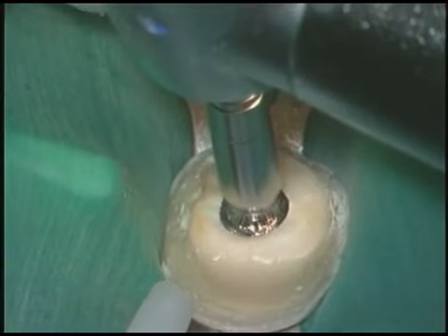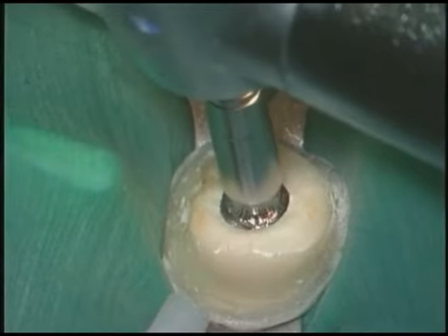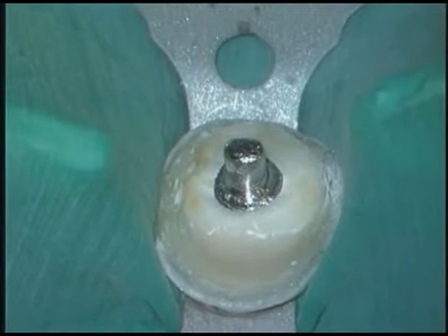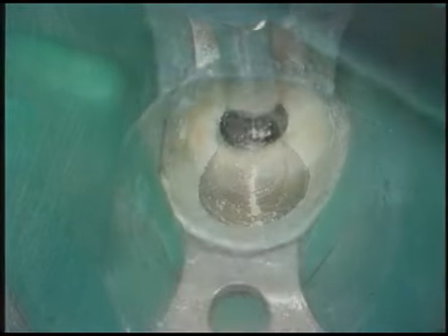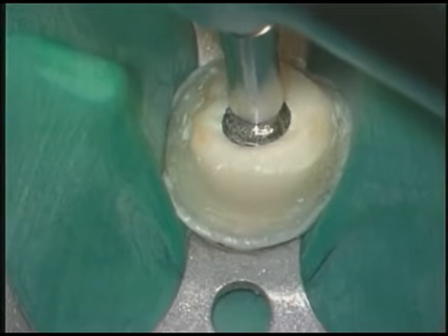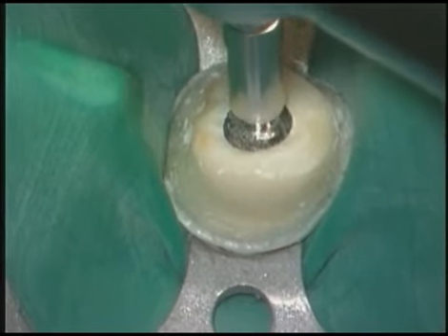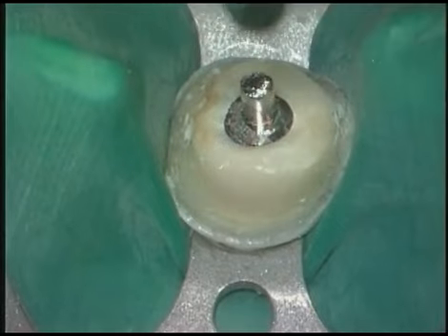I'll start with a number 5 trephine and I'll machine down the post, but because my reduction was imperfect, you can see that when I pull the trephine off, the number 5, the post is still not perfectly round. So now we just advance right to the next progressively smaller trephine, and by using the 5 first, it allows the 4 to machine down with greater ease, and this will machine a perfectly round cylinder.